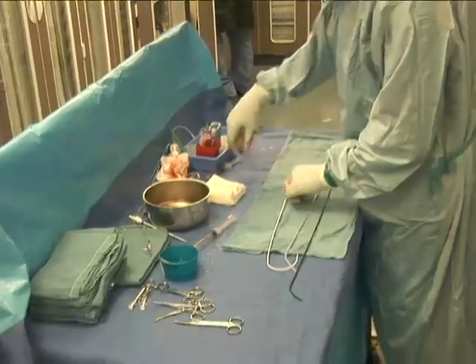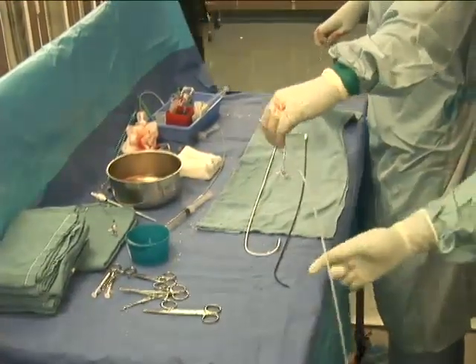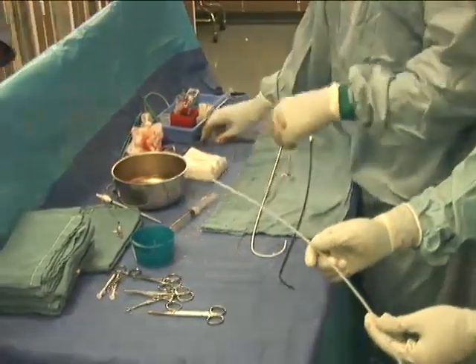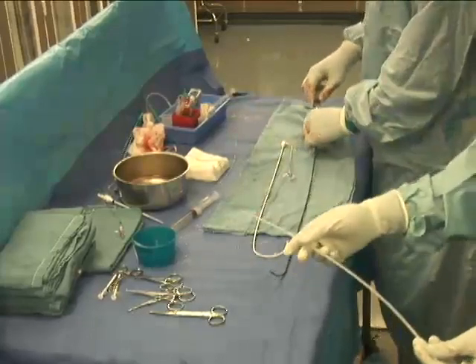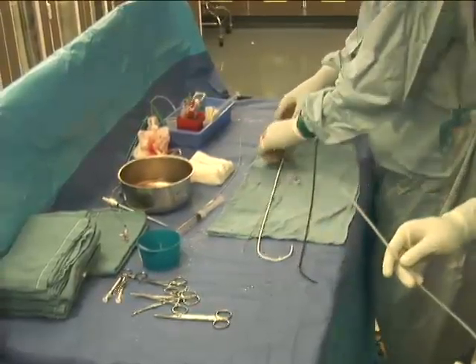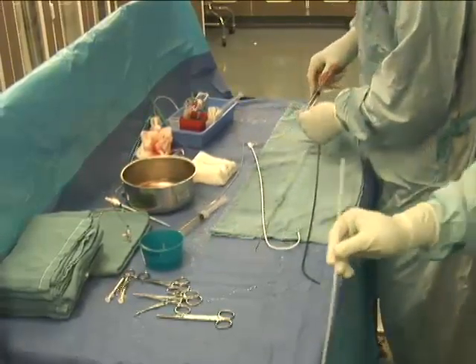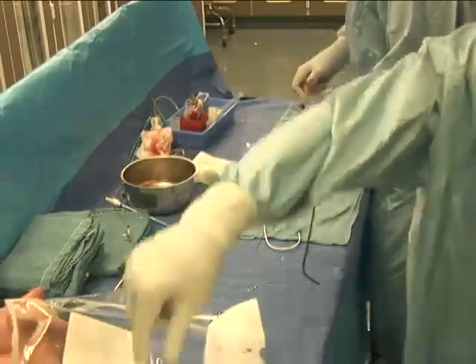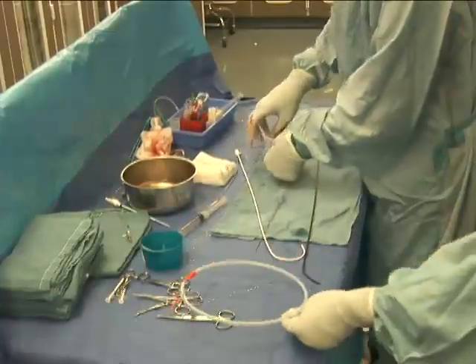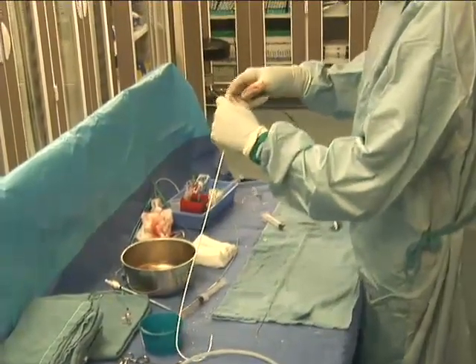The transseptal catheter and dilator are flushed, and the dilator inserted into the transseptal catheter. The Brockenbrough needle is flushed, removing the inner stylet to do so, and is placed inside the transseptal dilator. The needle is advanced to the tip of the dilator, and an assessment is made of the distance still present on the proximal end of the needle, typically using the width of 1 or 2 fingers to assess that distance.